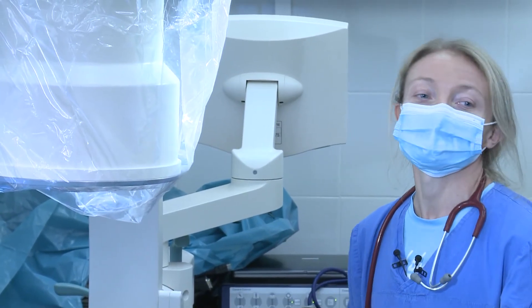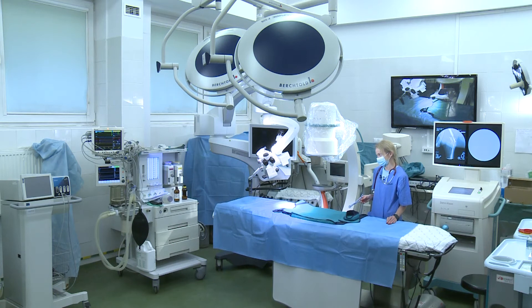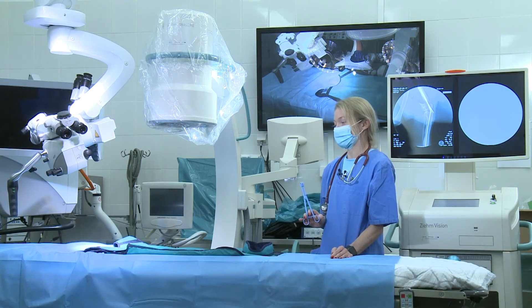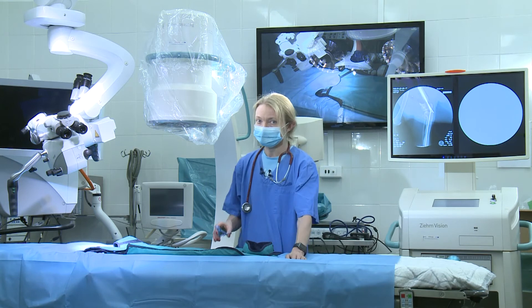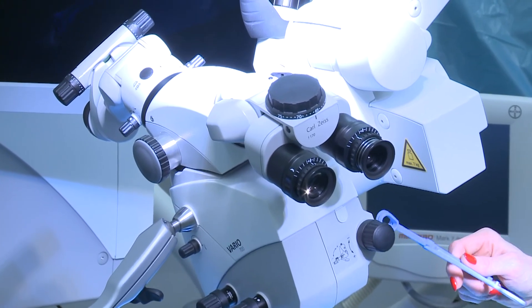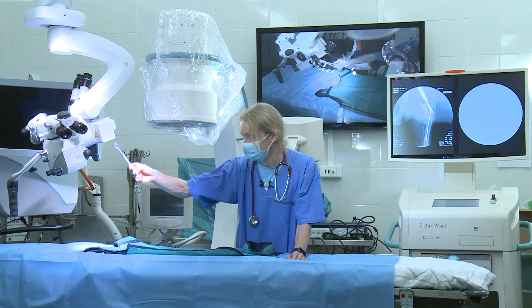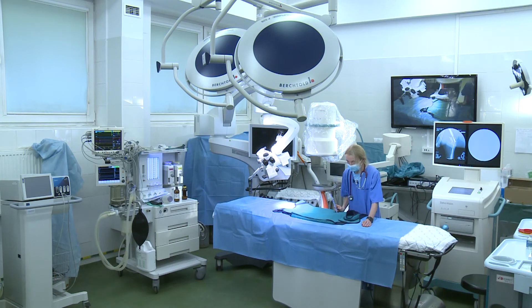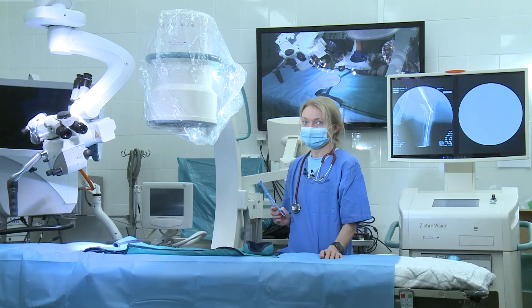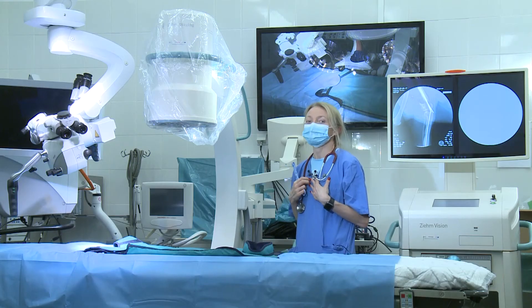So the C-arm not only allows us to do stationary imaging but is also very helpful during surgeries. If our surgery is what we call minimally invasive — meaning the operation field is very tiny and small — we have to use an operational microscope. This operational microscope allows the surgeon as well as the assistant to proceed with surgery, and whenever we want to control the results of our surgery very fast, we can use the C-arm device.